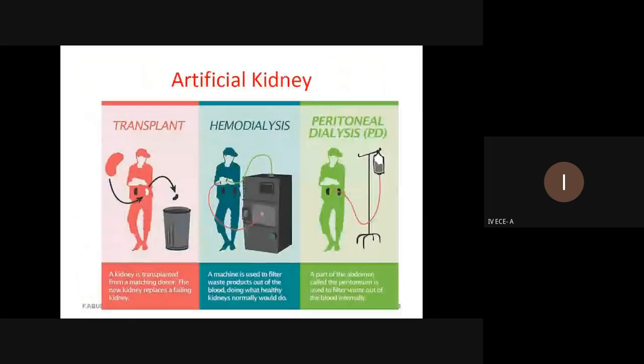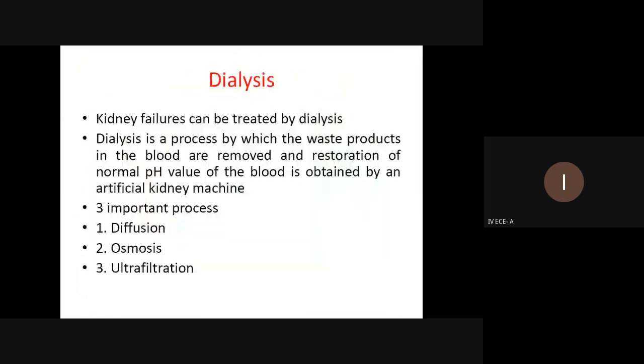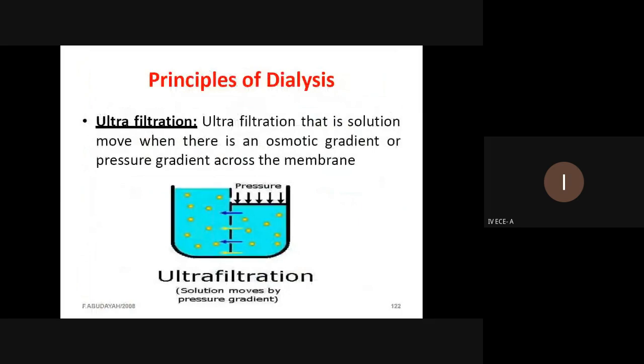Okay, so that was the dialysis unit. We have seen dialysis, then the defibrillator and pacemaker. These are all called assist devices. Without these devices we can't live a normal life.